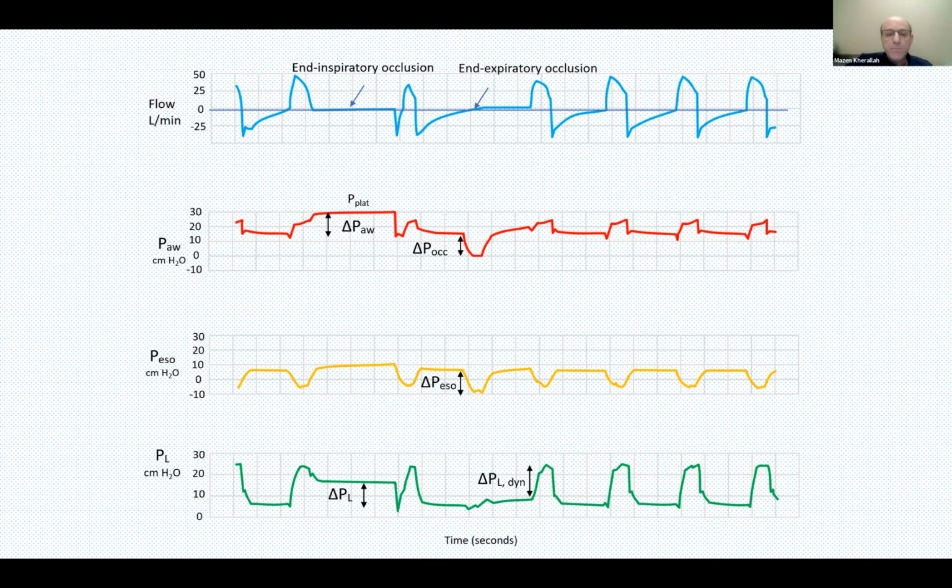But if this is what happened, the plateau is higher than the peak pressure, it means that the patient generated so much intrathoracic pressure with a breath delivery here. When you held the breath, at that time, the plateau needed to go up higher to keep that air inside.